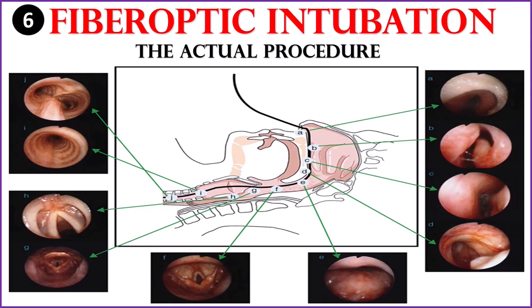We have covered several videos in the previous sessions discussing various aspects of fiberoptic intubation, including airway anatomy, topicalization, sedation, and the working mechanism of the fibroscope. In this video, we will discuss how to actually perform the fiberoptic intubation step by step.